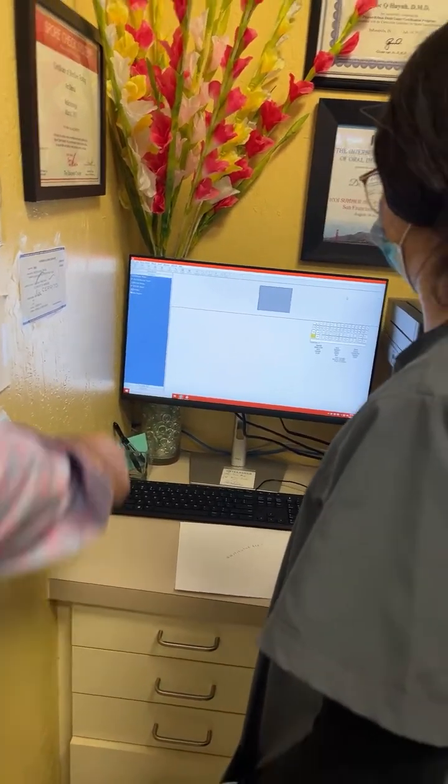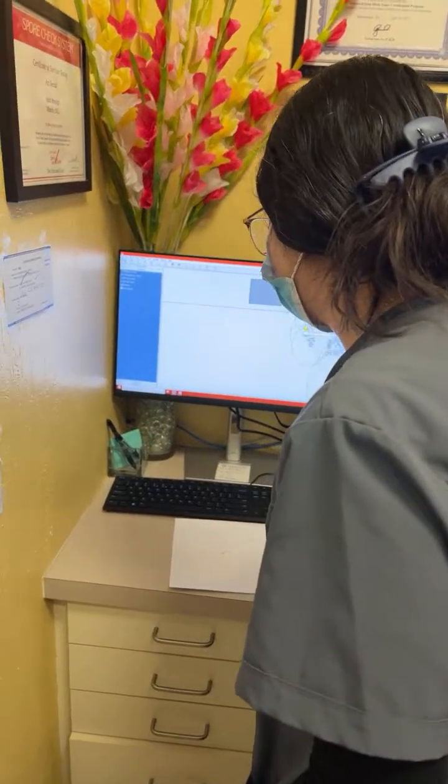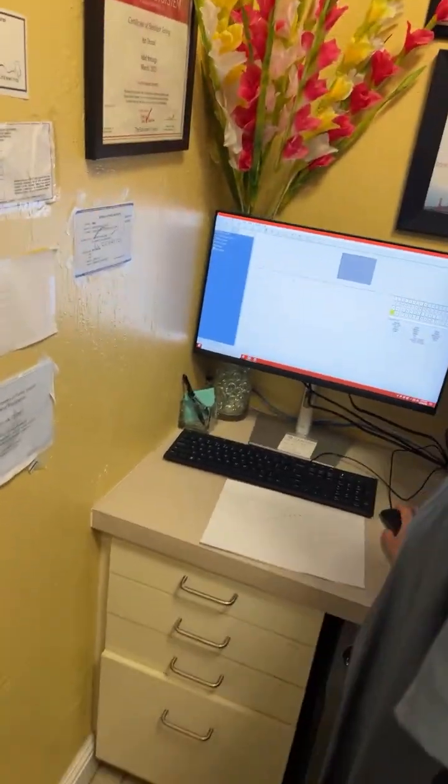It's not pausing. Can you do exam by type? Oh, it's not doing anything now. Looks like it's frozen or something.